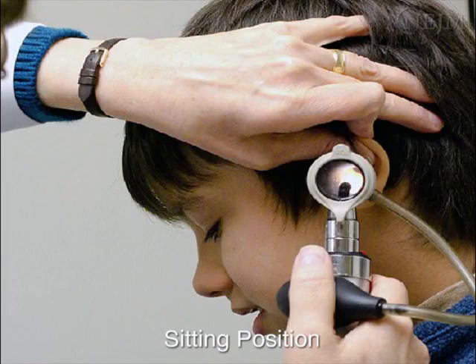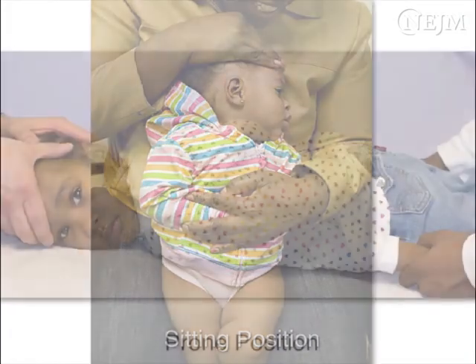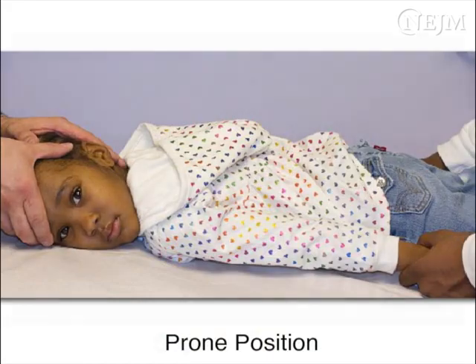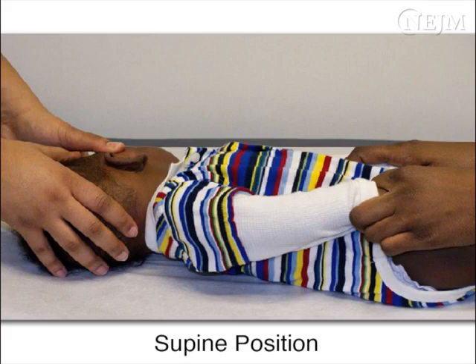Older children and cooperative younger children may be examined in the sitting position, either in their parent's lap or on the examination table. Uncooperative children are best examined while recumbent, in either prone or supine position. The head should be firmly immobilized by an assistant; a second assistant, usually the parent, braces the child's body against the examination table.